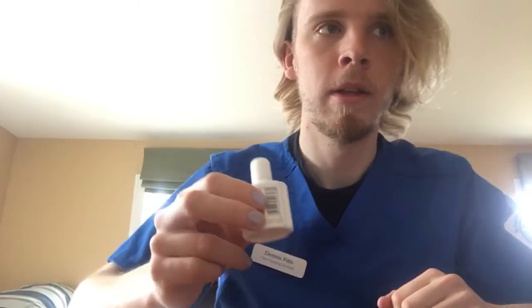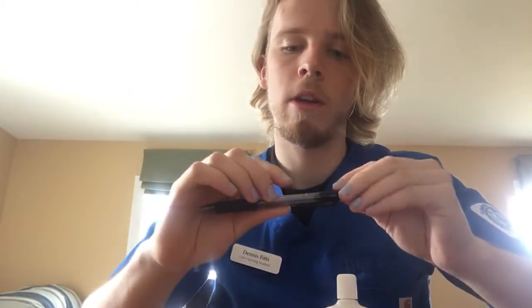So I've pulled up my insulin, and I have a 30 unit syringe. I'm using the 30 unit because it's the smallest one that will fit the dose that I need, so I can get the most accurate reading on it and get as close to 9 units as I can. So I'm going to take an alcohol swab, and I'm just going to scrub the top of the insulin vial for 15 seconds, and I'm going to let that dry, and I'm going to take my 30 unit syringe.